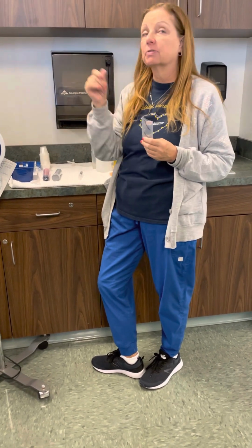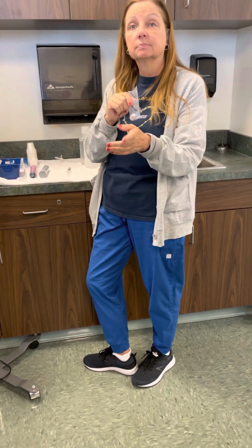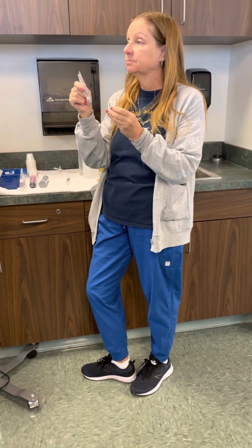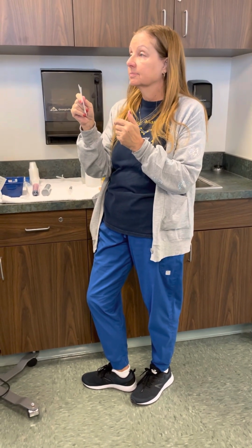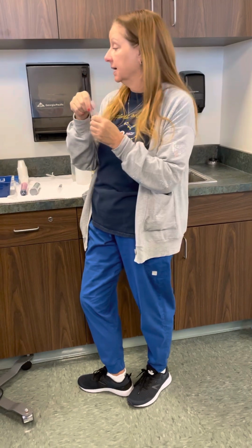So let's go over our patient rights. Right patient, right medication, right documentation, right time, right dose, right route, and the right indication, the reason to give it.